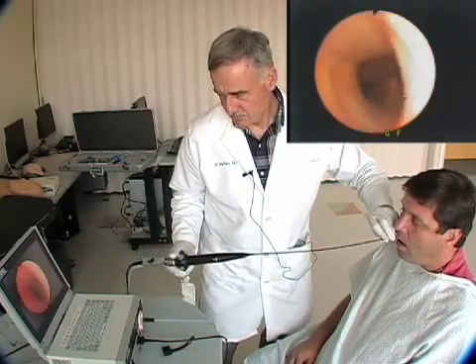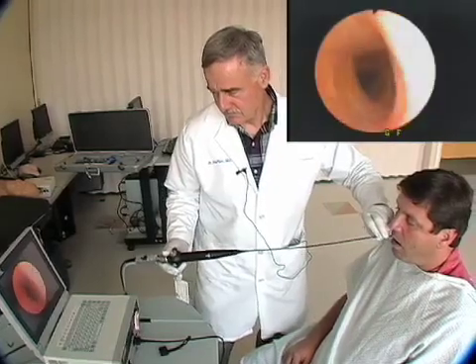The main stem — there it is right there. Beautiful, you look good, buddy. Here we go, coming back out.